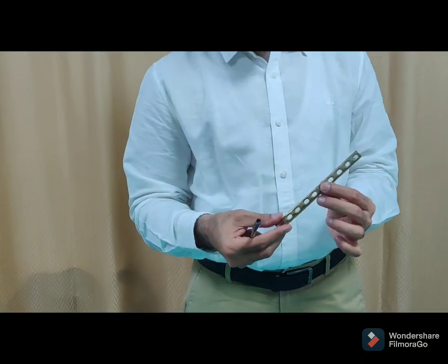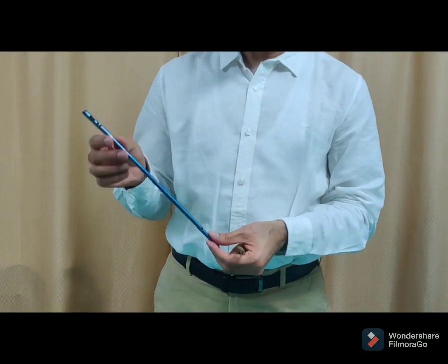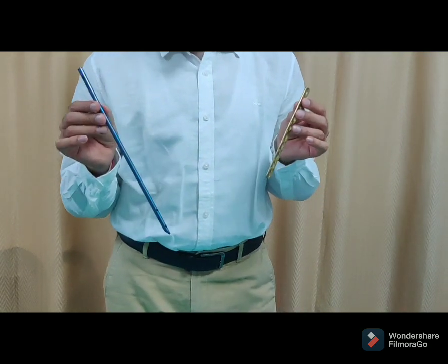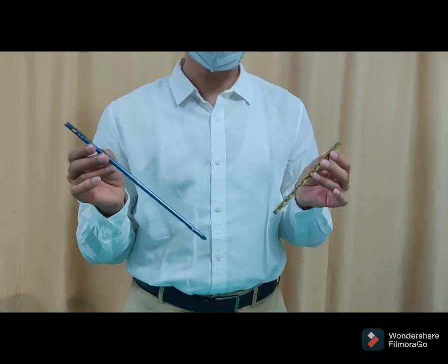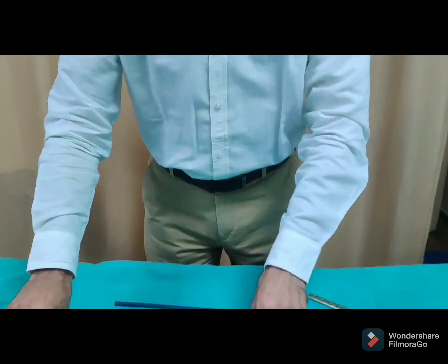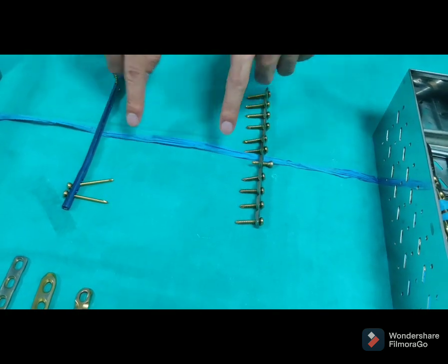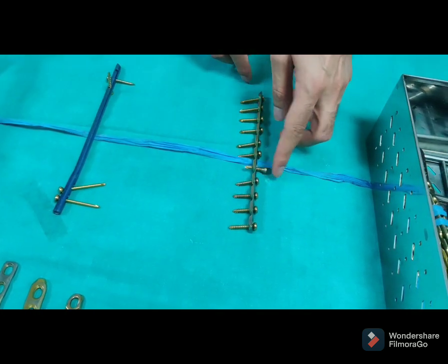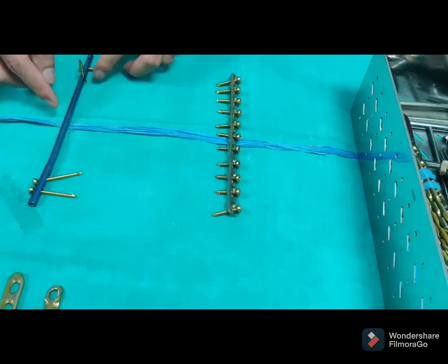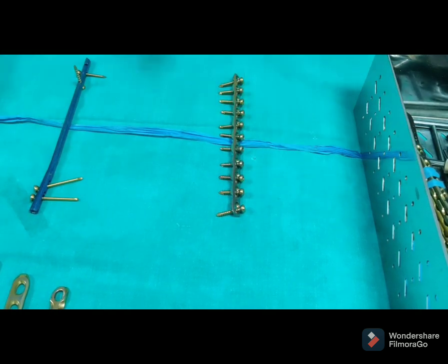Surgically, we can put a plate, or we can put a rod which is called an intramedullary nail. So these are two options. We will discuss both — what the benefit of each is. If we put the plate, it goes on both sides of the fracture. If we put the rod, we also fix both sides of the fracture using two implants.